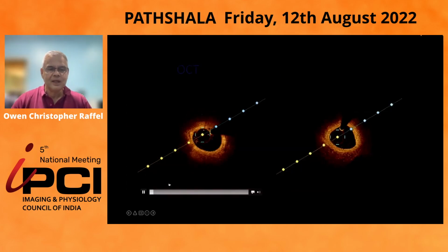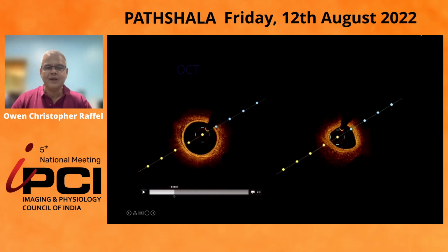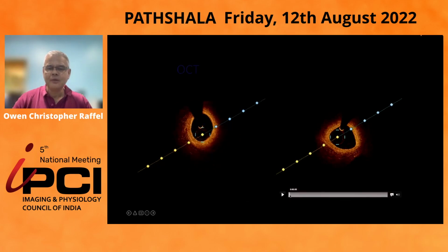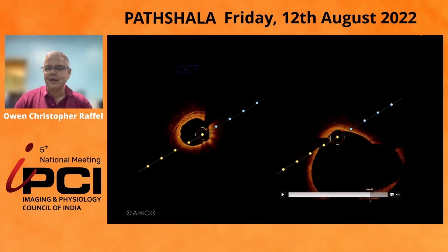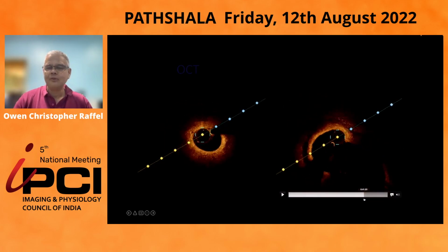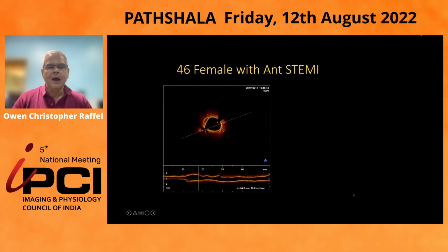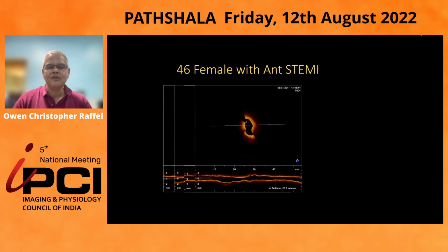And this is our OCT. Just to run it through in the interest of time, you can see often you see an adventitia, which is a little bit unusual, just distal to the dissection. And here, typical features of SCAD. Importantly, in the more proximal segment, what I want to show you is that this, in fact, extends into the left main. And it's here really important to get very good, clear imaging. And you can see an exit or an entry site here very clearly. This is some stills just demonstrating the same features.